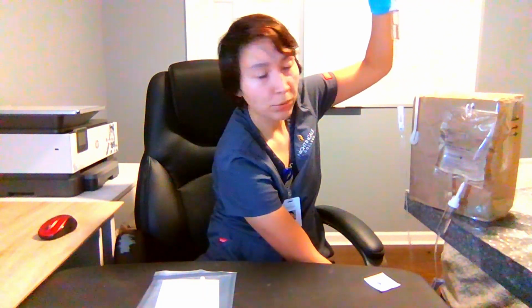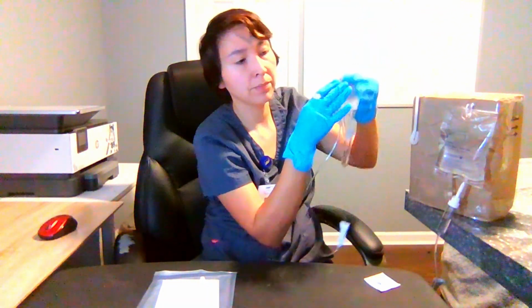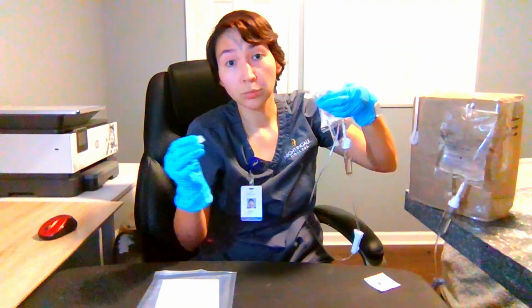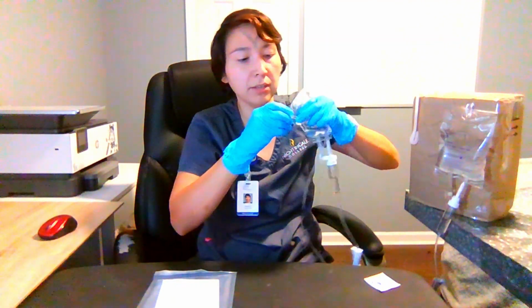All air is removed. There are no air bubbles. I've now fully closed the clamp. I'll recap the adapter end.